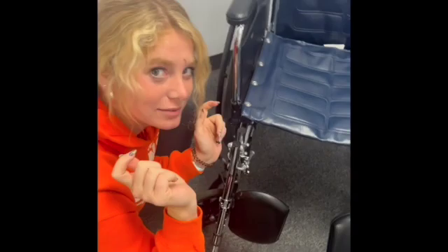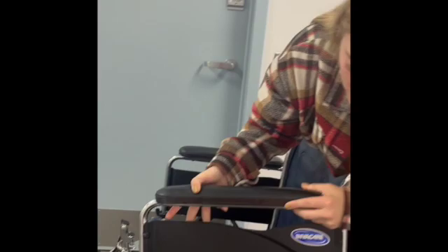For the armrest, you're going to move this knob right here, and then there's a little button right here in the back — you're going to push it in and it comes right off. Same thing with the other side. To put it back in, you put it back and then turn the knob.